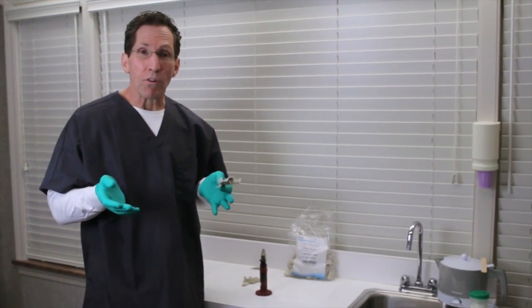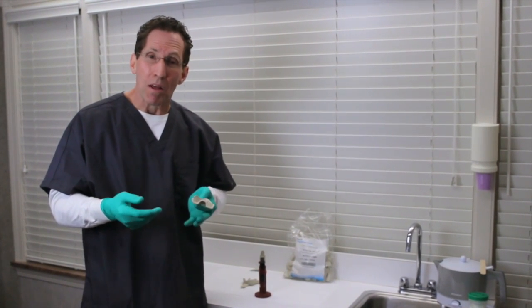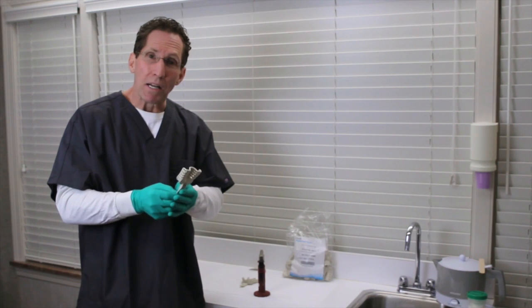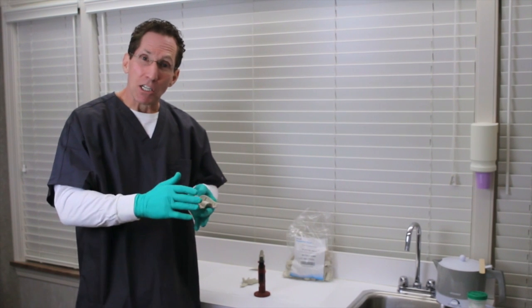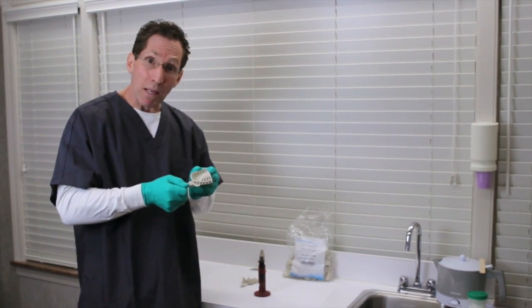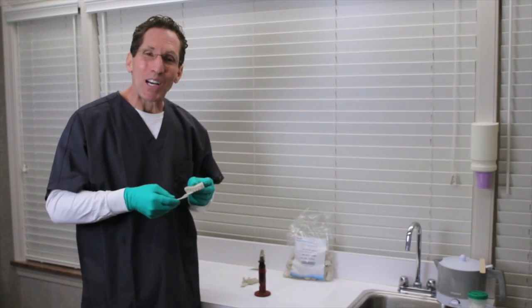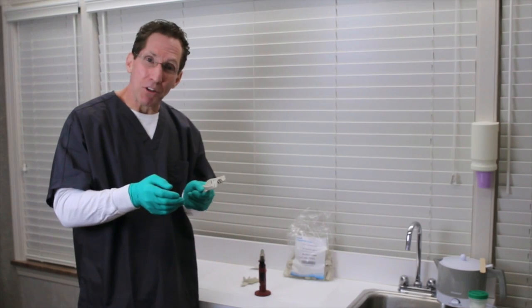If we use a metal tray, certainly metal trays are wonderful, but you can't change them. You really can't modify them other than adding on to them by border molding. With these trays, we can actually modify the shape. And I will tell you that routinely, 90% of the time, I'm going to do the exact modification I'm going to demonstrate to you here. The actual modification will only take place after we've inspected the patient's mouth, which will be in our next procedural section here. But let me show you just briefly how we actually do modify the tray.